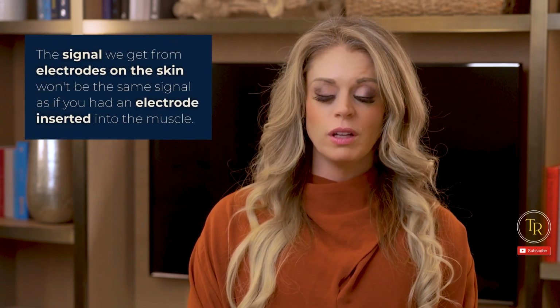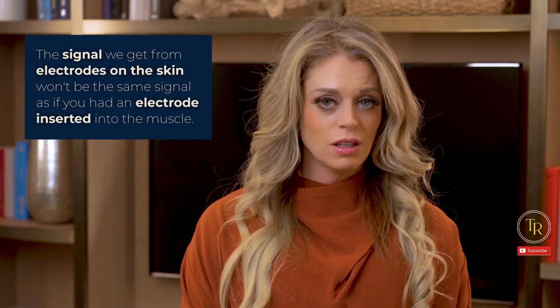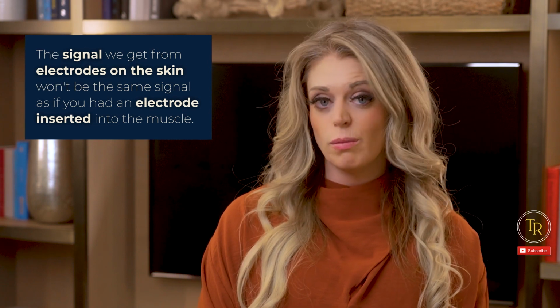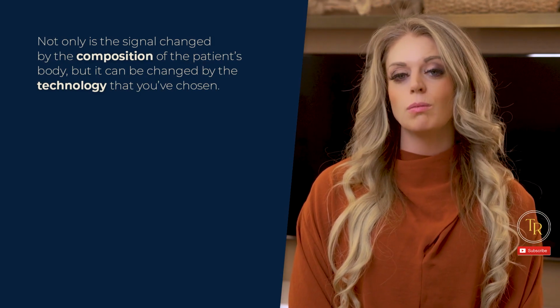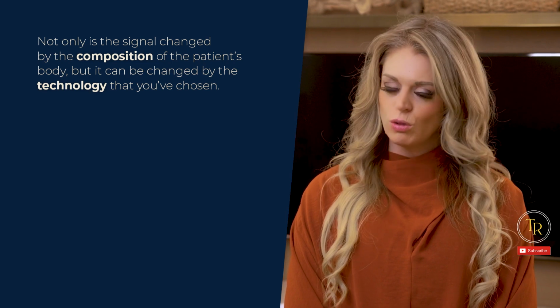The signal we get from electrodes on the skin won't be the same signal as if you had an electrode inserted into the muscle. Dr. Gabby Constantinescu describes the change of the signal as similar to listening to a group of people talking through a wall versus an open door, or playing a guitar in a soundproof studio versus a regular room. The stimulus that creates the signal is the same, but our perception of it is different based on the circumstances surrounding it. Not only is the signal changed by the composition of the patient's body, but it can be changed by the technology that you've chosen.